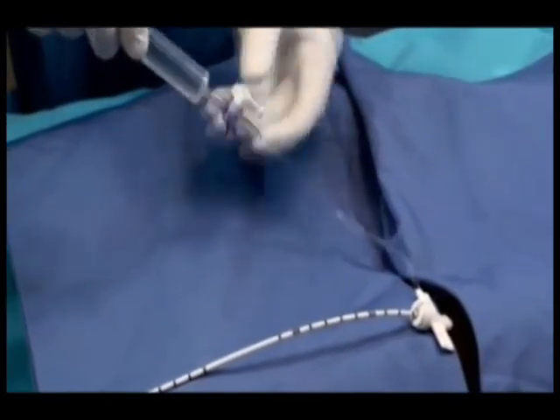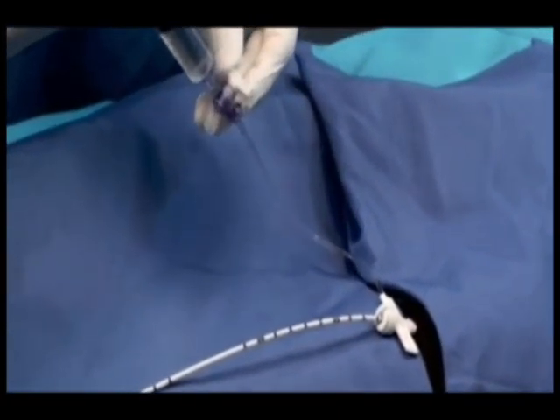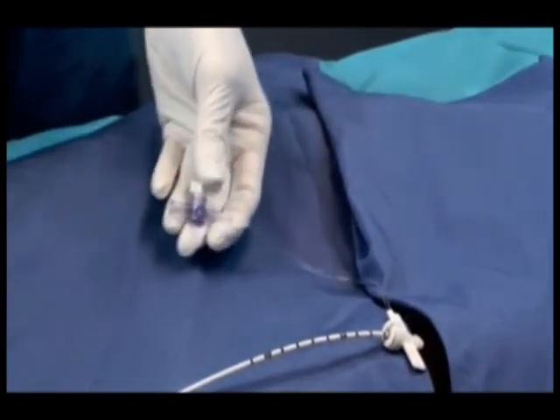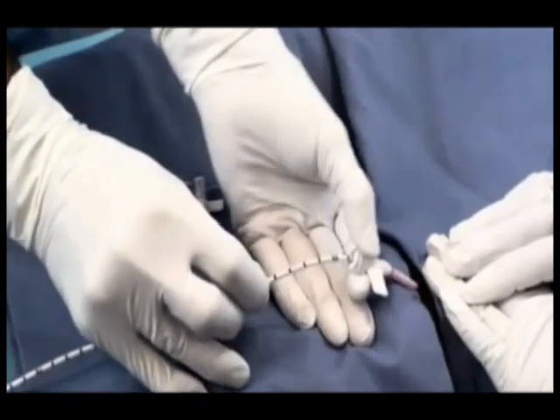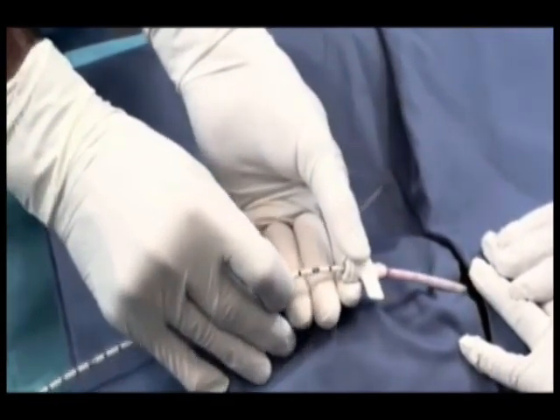Carefully flush the side arm of the 13 French introducer and be sure the stopcock is closed after flushing to prevent bleed back. Then remove the 13 French peel-away introducer completely from the artery over the catheter shaft and apply manual pressure above the puncture site.